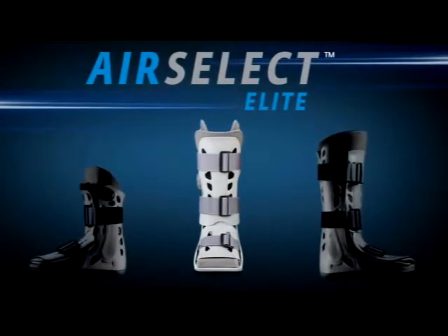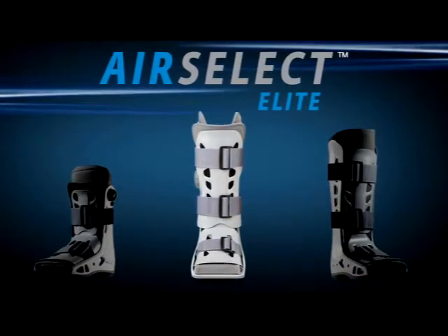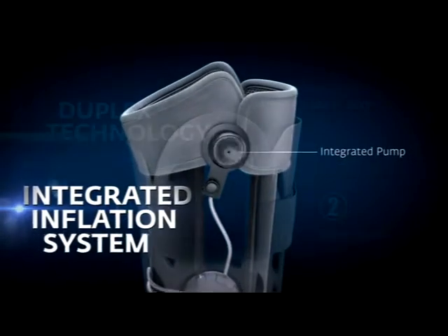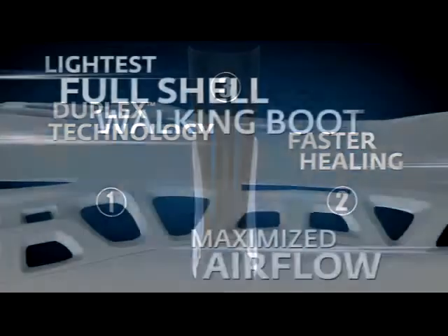The AirCast AirSelect Elite Walking Boot puts comfort, control, and healing in the hands of the patient. With the most advanced pneumatic walking brace available, using the AirCast Elite is as easy as 1, 2, 3, 4.